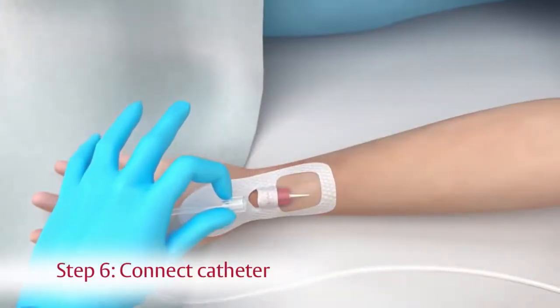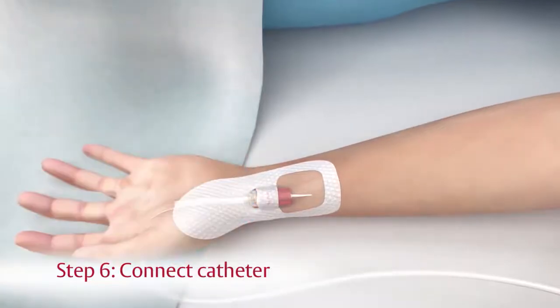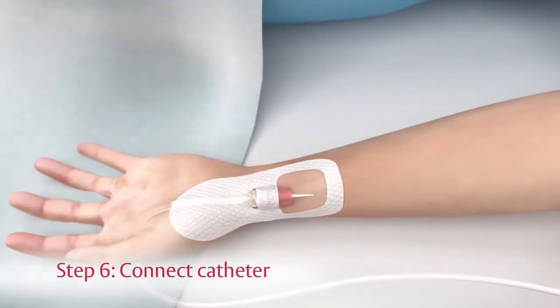Step 6. If not already connected, connect the TruWave's pressure tubing to the patient's catheter.